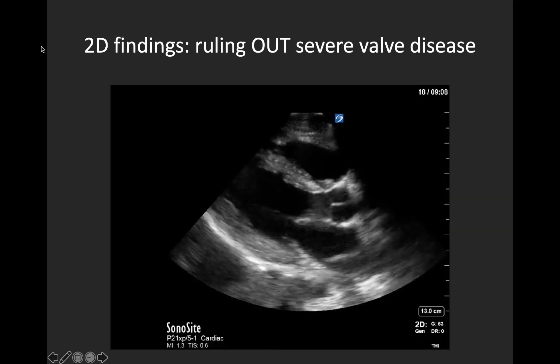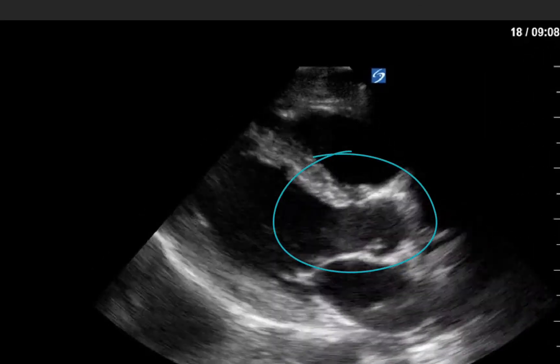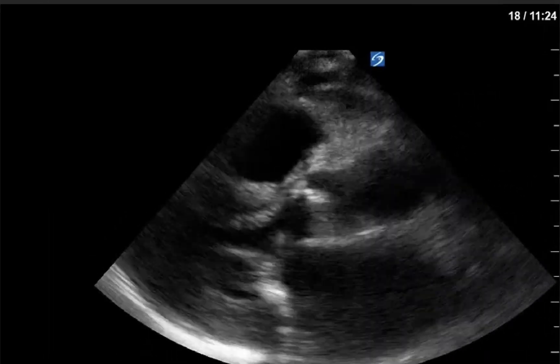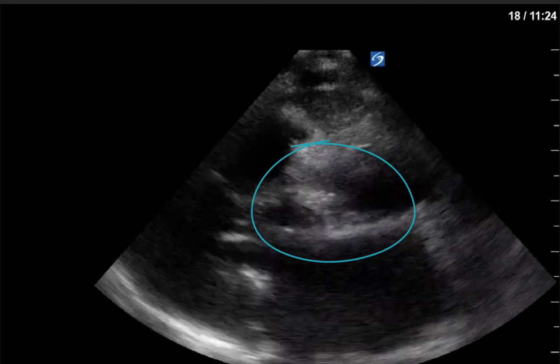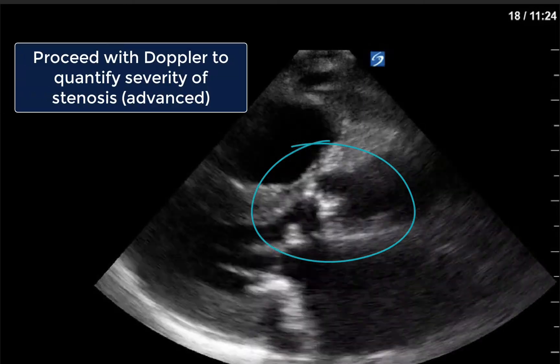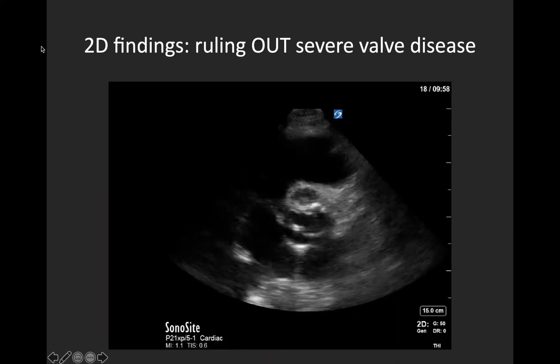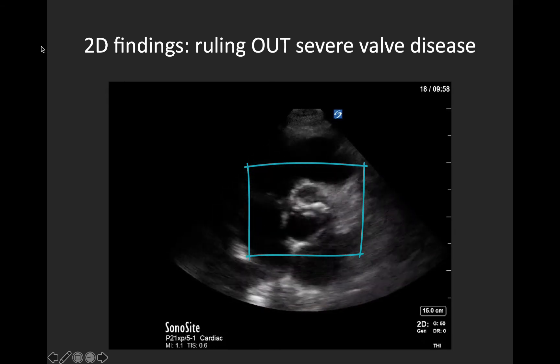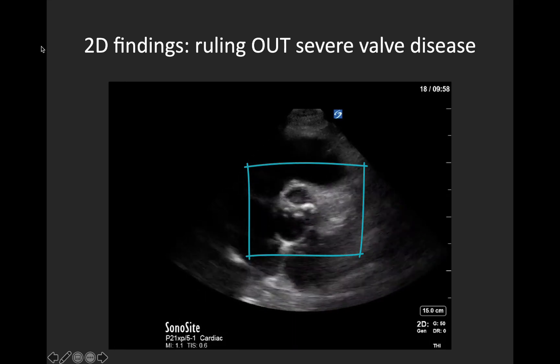Here we have an example of a normal parasternal long axis clip highlighting those thin, pliable aortic valve leaflets opening widely in systole. In contrast, we can see a parasternal long axis view where the aortic valve leaflets are hyperechoic, thickened, and barely mobile — this is not normal and would warrant more advanced imaging. A parasternal short axis view can also be a good view to note restricted opening of the aortic valve, and here we also see an example of a bicuspid aortic valve as an example of variant anatomy.